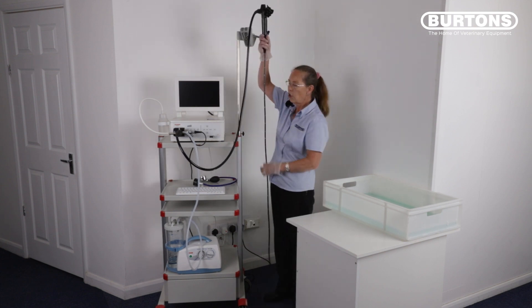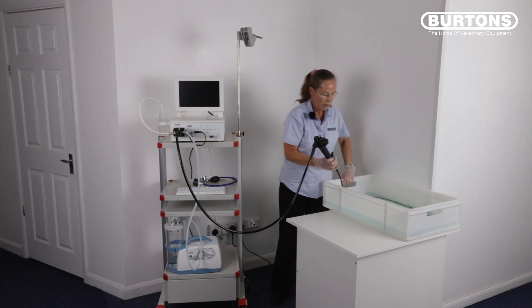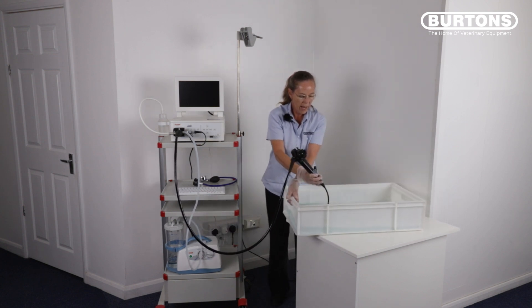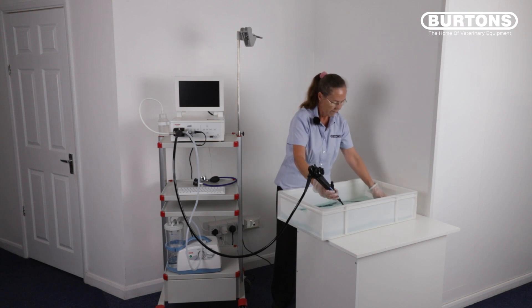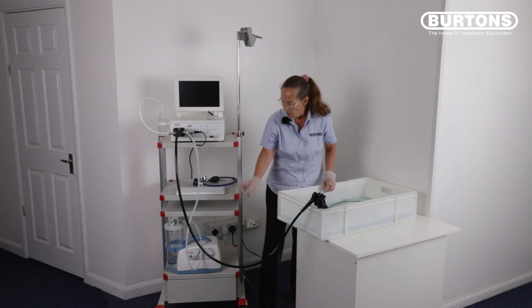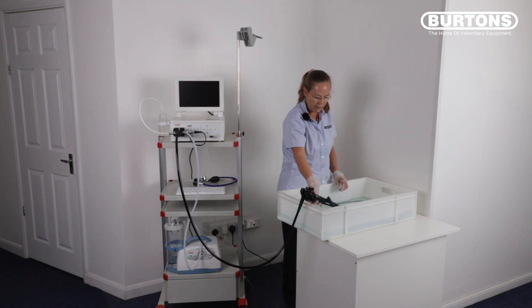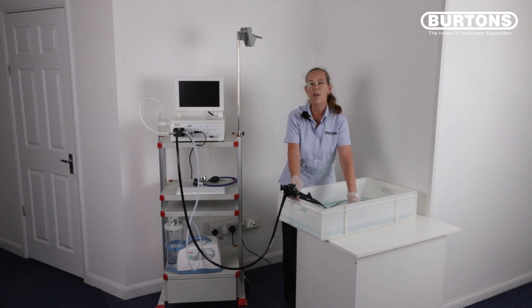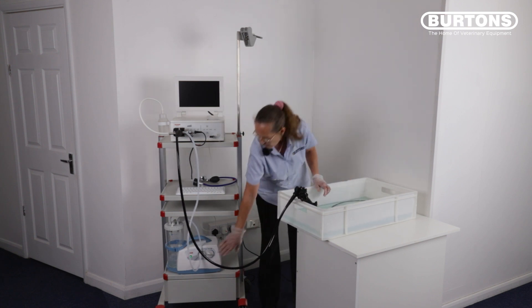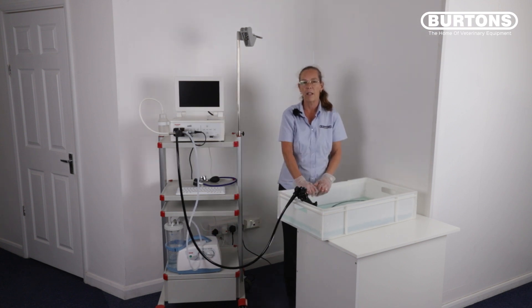Take your patient tube and immerse it in your pre-prepared enzymatic, made up to your manufacturer's dilution rates. Turn your suction unit on, push and hold the red button down and aspirate approximately 150 to 200 millilitres of enzymatic through the scope. Turn the suction unit off and leave the scope soaking for half of its allotted time.